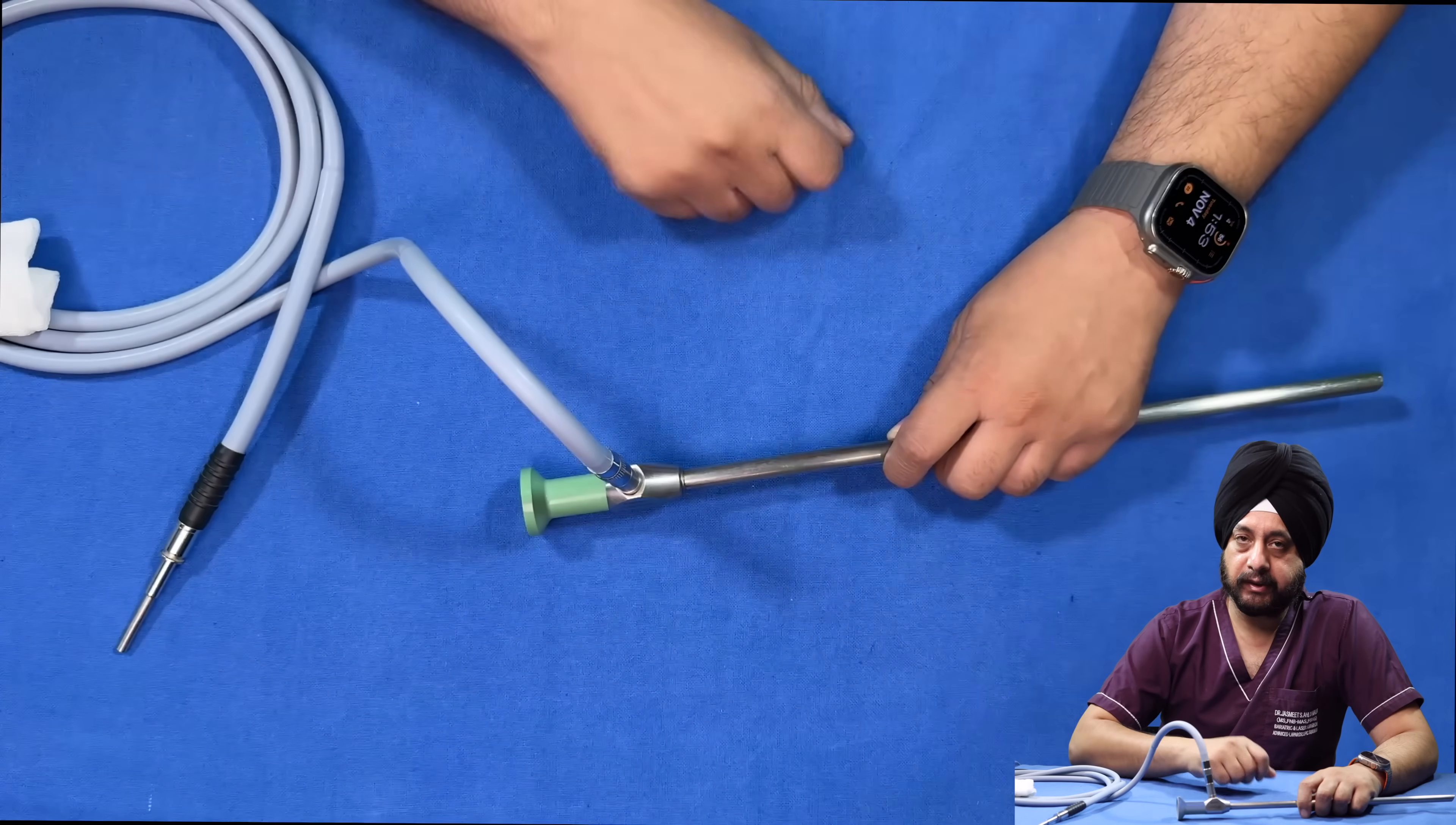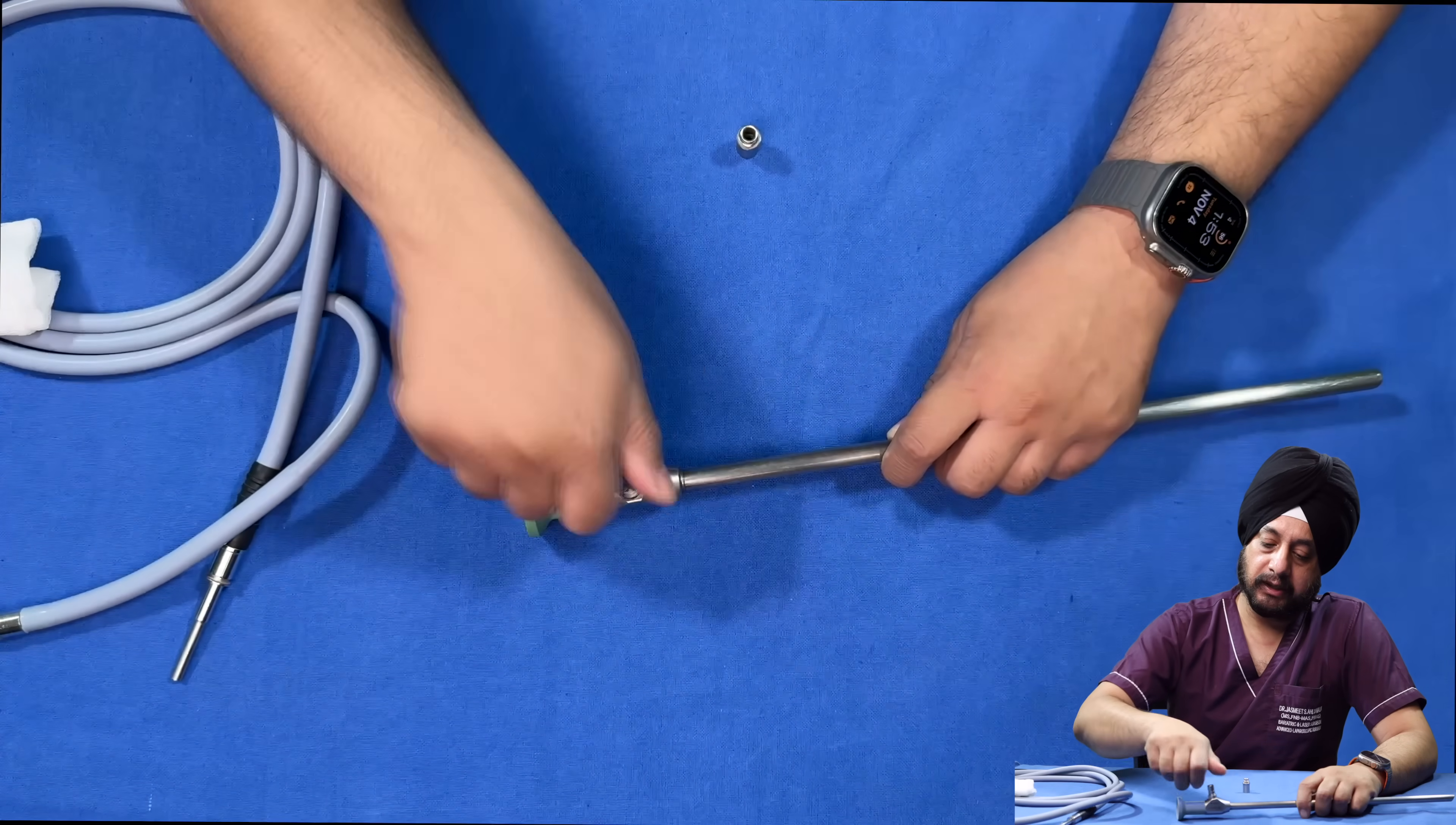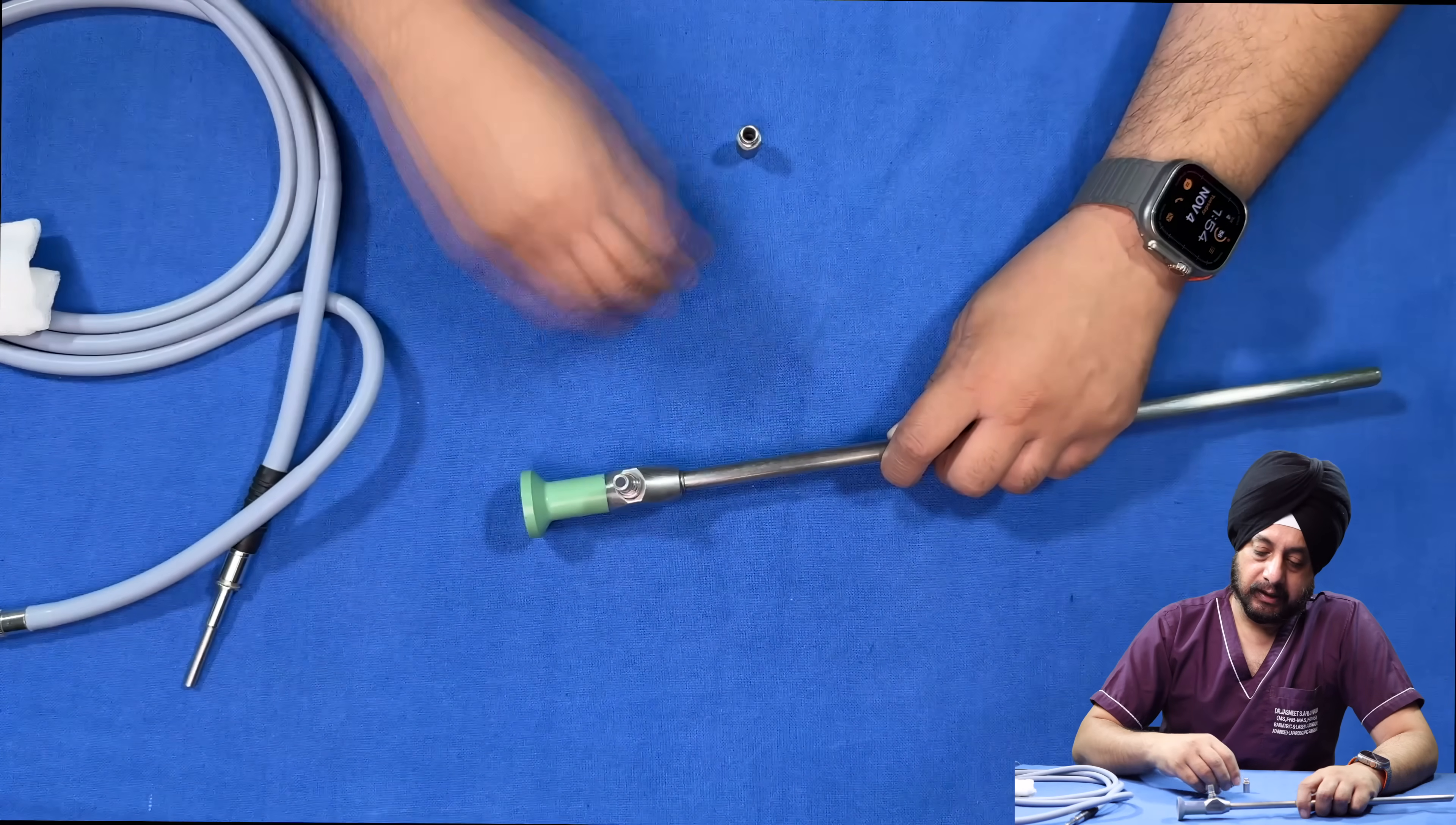Depending on the model you have, this particular model connects on top of this adapter. With a different cable, you remove one adapter. Some cables connect when you remove the next adapter as well.